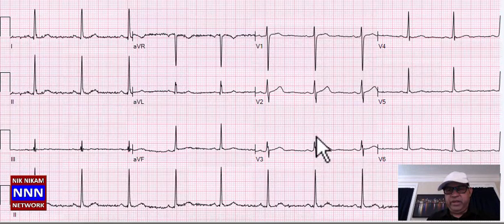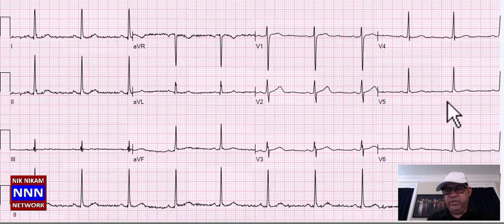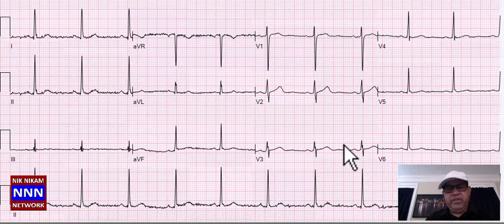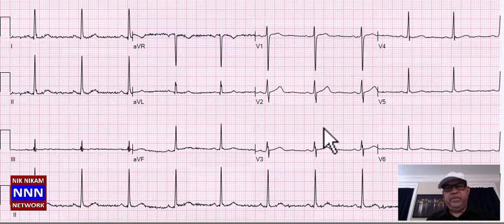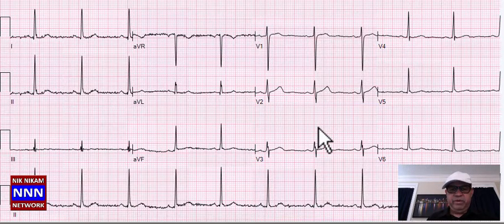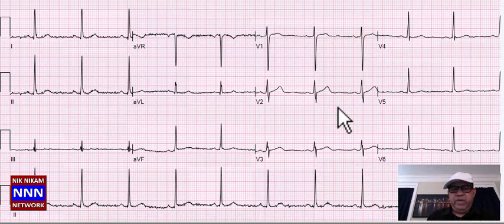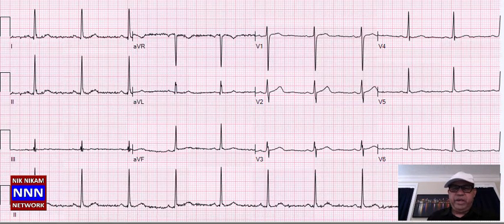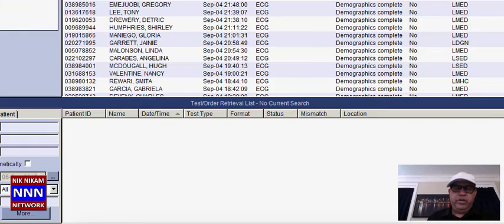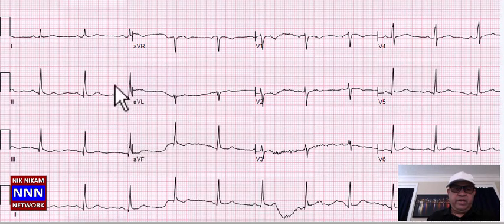Now we have sinus rhythm: T-waves flat inferiorly, T-waves okay anteriorly, T-waves flat laterally. So we have infero-lateral T-wave changes — abnormal findings. This is an abnormal EKG with normal sinus rhythm and non-specific ST-T changes.